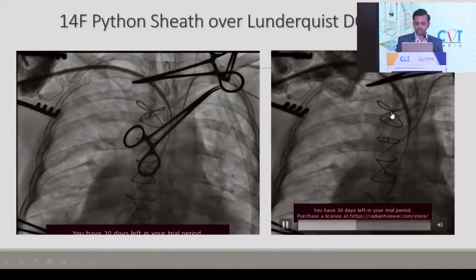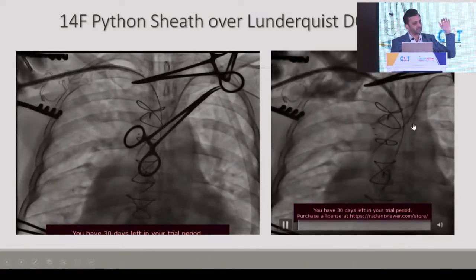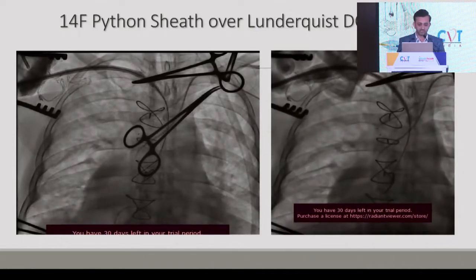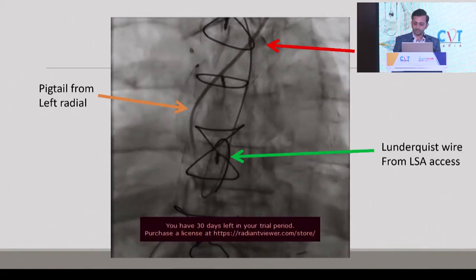So the sheath went in. This is the mouth of the tip of the sheath. You have to make sure the tip of the sheath lies into the arch. And this is the aortogram. We see a lot of hardware here.